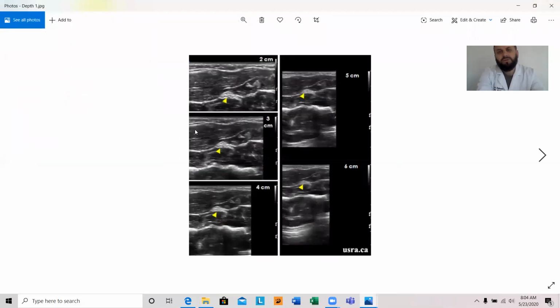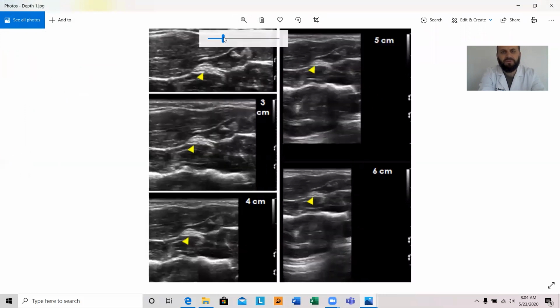Depth is very important, because if we look at this image, let me make it a little bit larger maybe. Always choose the right depth, because it takes the sound longer to travel all the way to the last boundary and come back. So always choose the right depth.